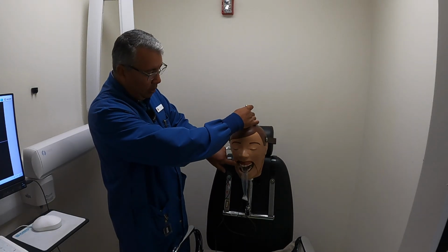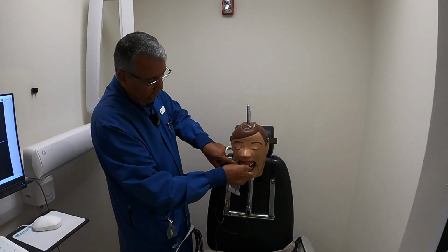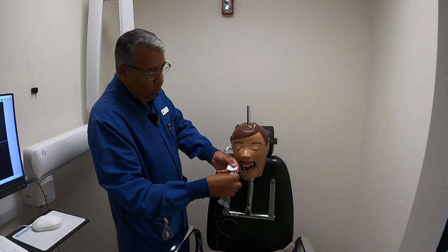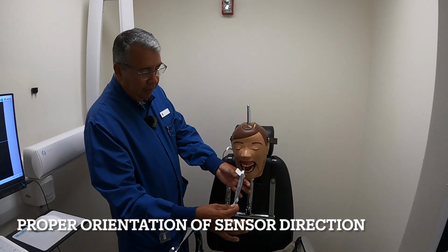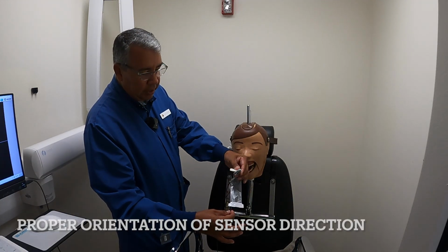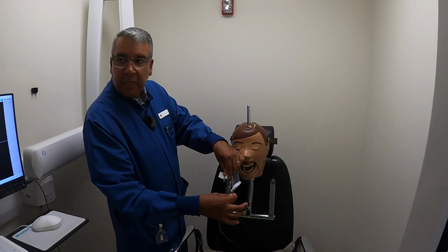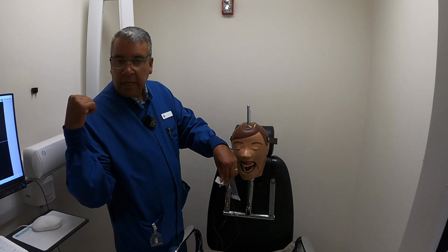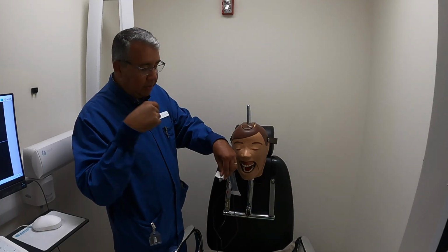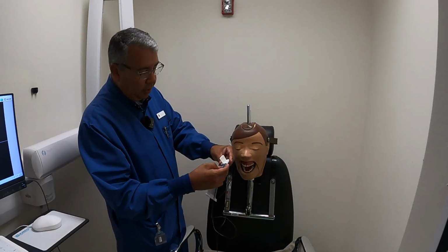Then I'm going to go ahead and close down. Now, I do want to make this note. I'm going to actually take this back out of the patient's mouth. When you place the sensor in the patient's mouth, that sensor should be coming straight forward. We should never have it going this direction, where the sensor goes to the back of the patient's mouth and then returns out the front of the patient's mouth. It's going to look like you took the opposite side, and you'll be frustrated really quick.